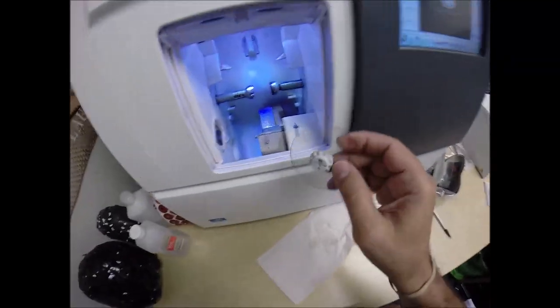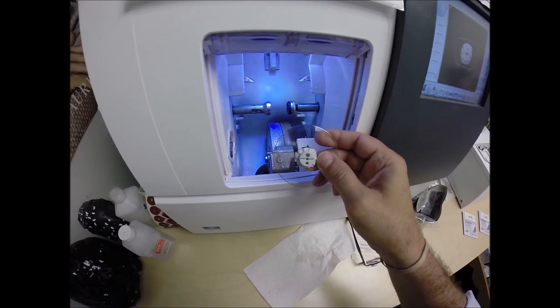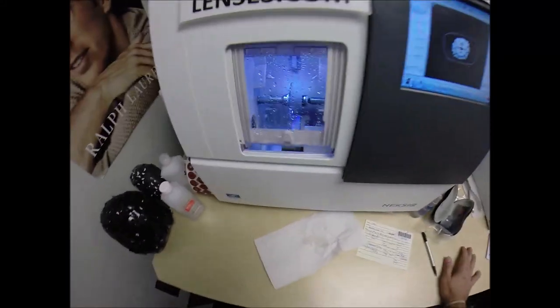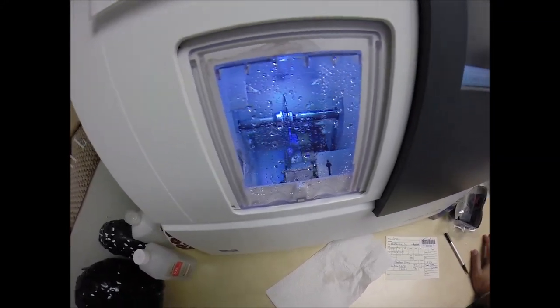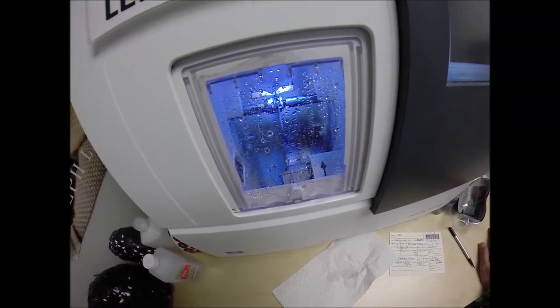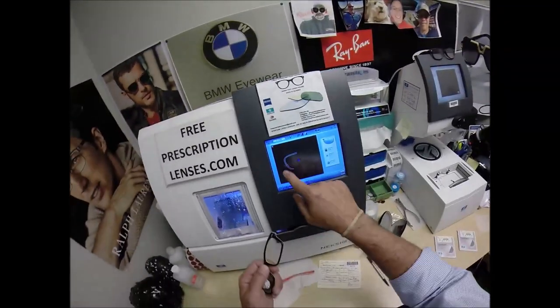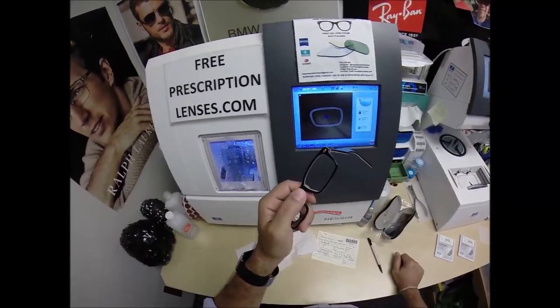Place the magnet into the Chuck, the Charles, the Chucky Baby, the Chuckarama, or today I'm calling it the Jose. Hit the green start button just like before. The door closes, the clamp shuts. The lens is going to be traced again by the two white styluses this time to make sure it's large enough to fit into the left side of the frame. And you can see as it's going around tracing the shape of the left side. Ding! You may now turn the page.